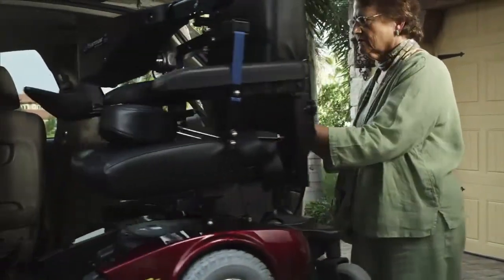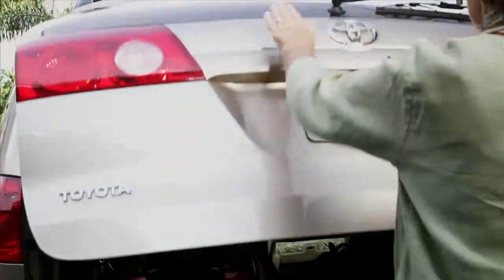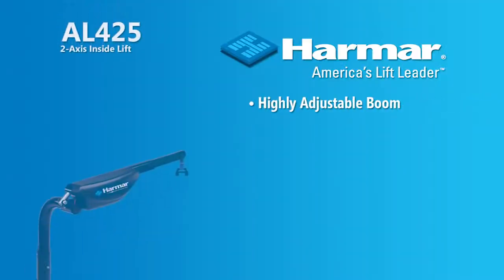Lifting and rotation are effortless and automatic. An optional wireless remote control offers even more convenience.